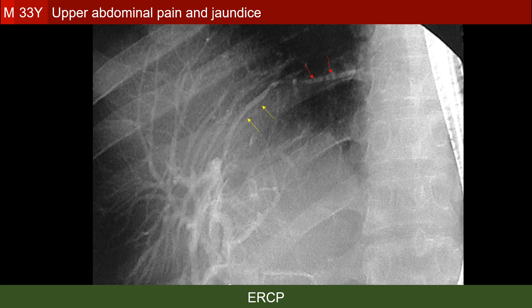Putting things together, this could be rupture of the hydatid cyst into the bile ducts. Therefore, the contrast medium is leaking inside the spaces of the cyst on one hand, and on the other hand, the contents of the cyst — the tiny constituents like the scoleces or the sandy debris — are going inside the bile ducts. These are probably responsible for the obstructive jaundice, as they cause transient obstruction of the bile ducts.